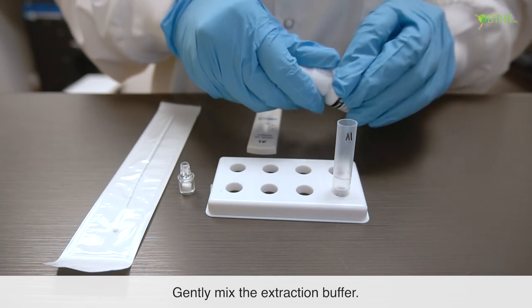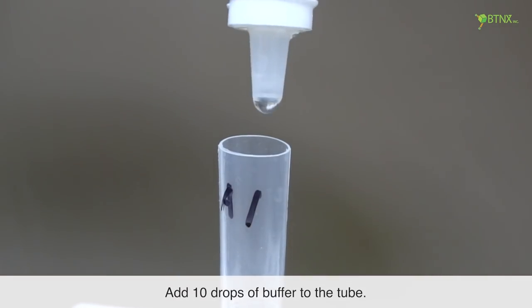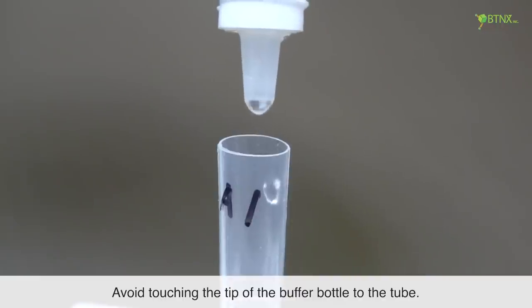Gently mix the extraction buffer. Add 10 drops of buffer to the tube. Avoid touching the tip of the buffer bottle to the tube.